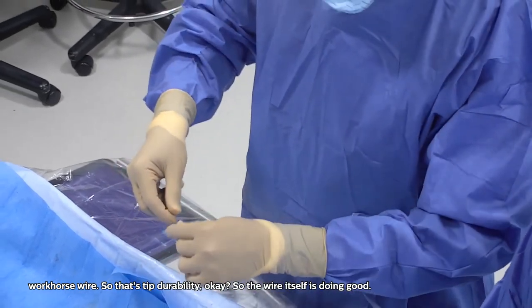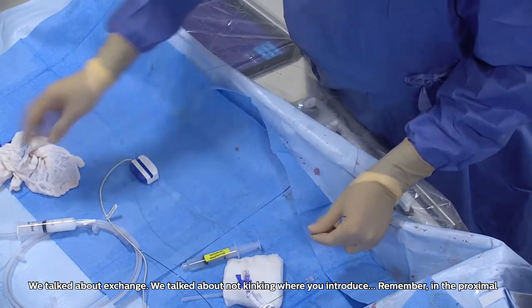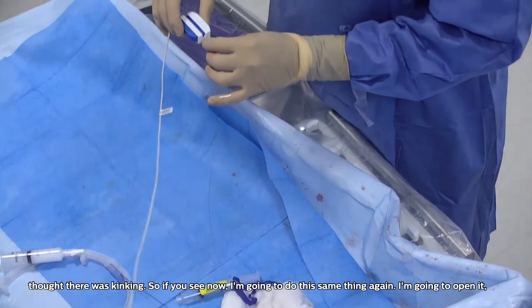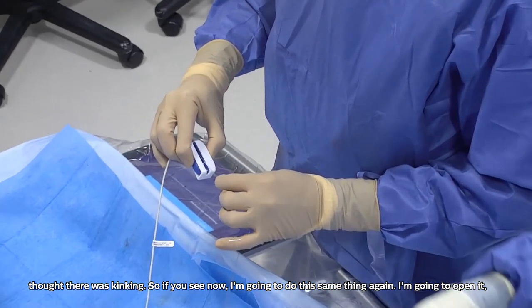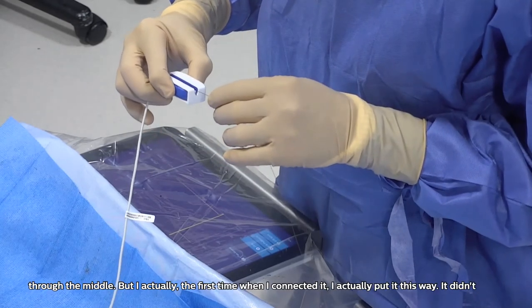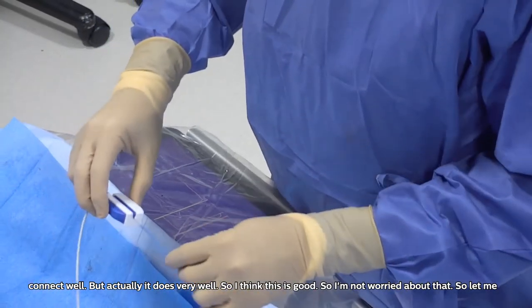So the wire itself is doing good. We talked about exchange. We talked about not kinking where you introduce. Remember, in this part, the distal is the tip. The proximal is where the connector is. So the proximal part is where you thought there was kinking. So if you see now, I'm going to do this same thing again. I'm going to open it. Wire is disconnected. Gives me the error. And then I connect it again, and it's connected again. It's beautiful. So you want to make sure it comes through the middle. But actually, the first time when I connected it, I put it this way. It didn't connect well. But it actually does very well. So I think this is good. So I'm not worried about that.